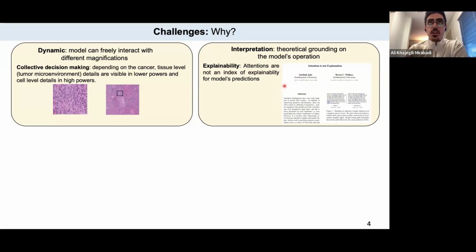And usually people interpret attentions as relative importance, but there is no evidence or proof to consider it as an explanation for what the model does. But depending on our architecture, it can vary.